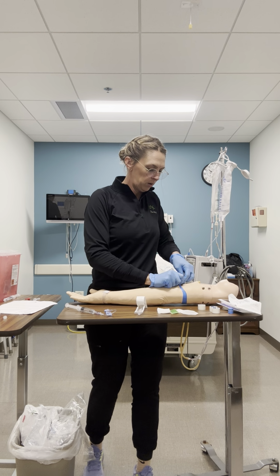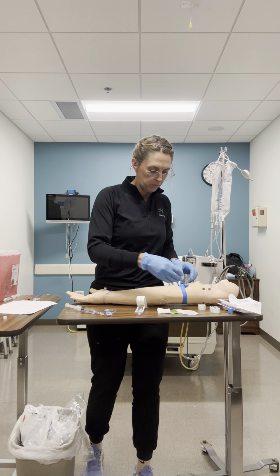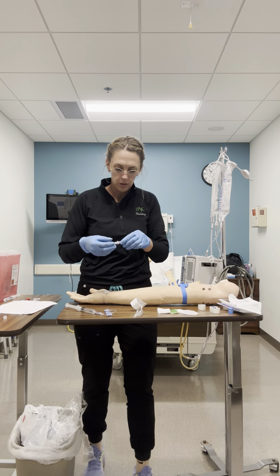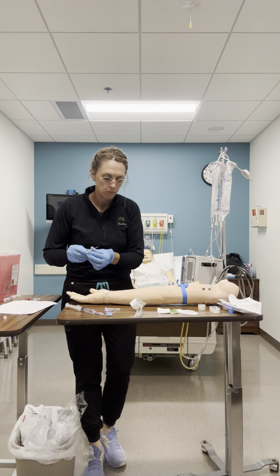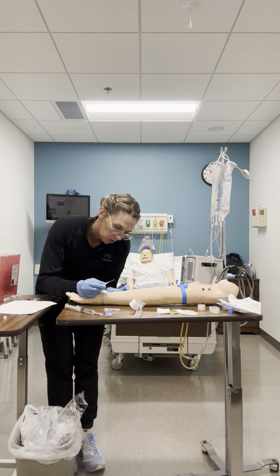I'm gonna retie my tourniquet. Get my needle out and ready. I'm gonna anchor the vein just below, and I'm also gonna anchor just above.